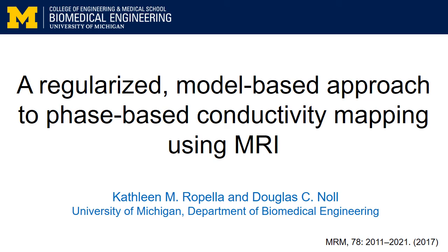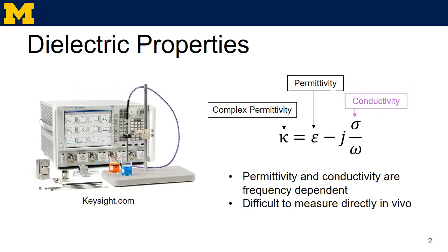I'm from the University of Michigan, and I'm going to discuss the paper entitled A Regularized Model-Based Approach to Phase-Based Conductivity Mapping Using MRI. I'll begin by describing what we're actually measuring, and that is dielectric properties.